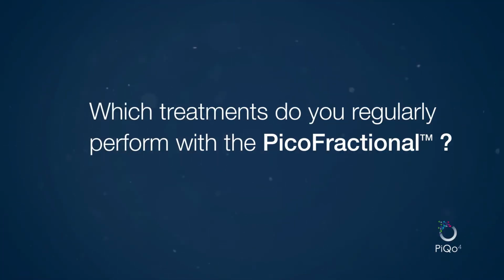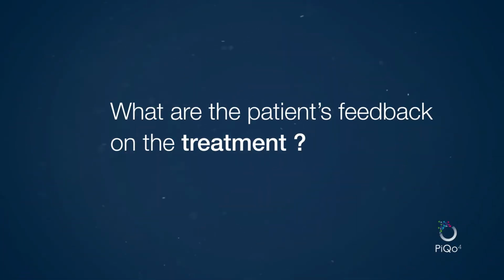I think what I like most about using the PicoFractional is its ease of use, the fact that you have very little downtime, and there's a high level of patient satisfaction. That's kind of a funny thing, because there are so many treatments you can do with it, and I find that each treatment has its own specific place and time. So I would say that I use all of them.